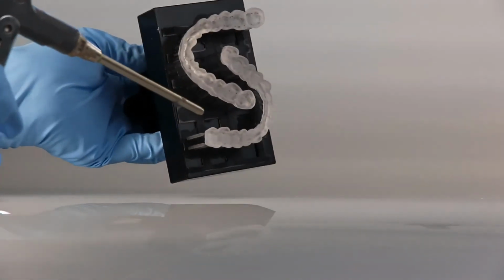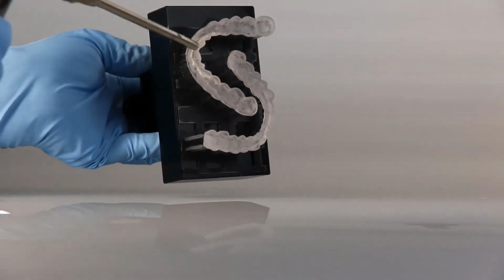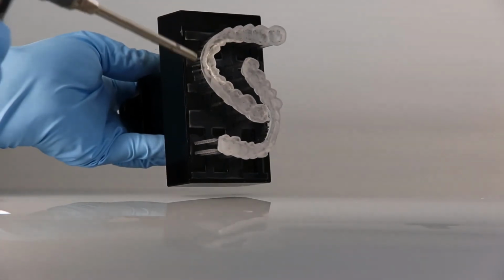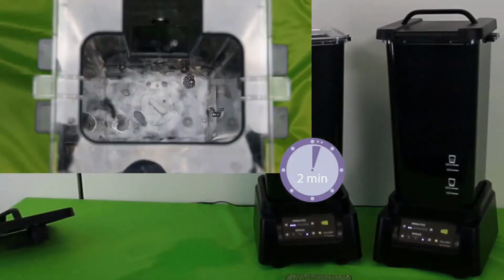After the finish of the pre-cleaning, the object must be blown off with compressed air, and then cleaned again in the second, clean isopropanol bath. The second cleaning phase for all Dima print materials is 2 minutes.